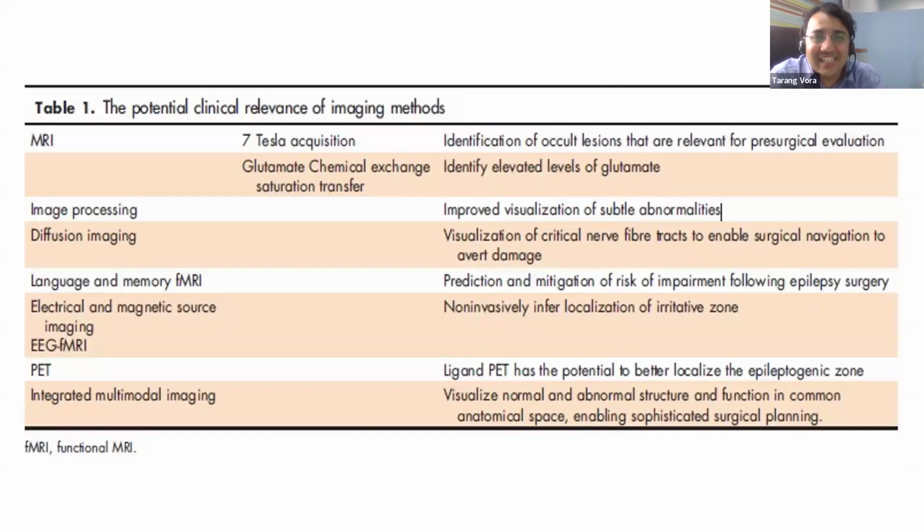So till now, we have just discussed the basics of epilepsy imaging. Currently, all the centers have 3 Tesla MRI. People have started acquiring 7 Tesla MRI so that some occult regions which may not be visible usually can start to become more visible. Diffusion weighted images, fMRI, EEG, PET, all of this are integrated together to call something multimodal imaging. This multimodal imaging helps the surgeon decide which part of the brain to resect to give the patient good seizure freedom.